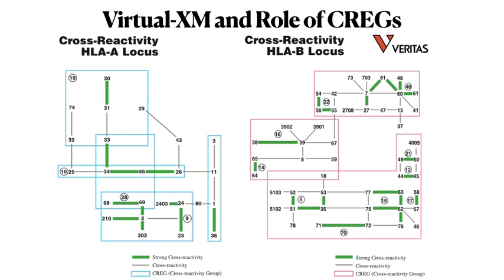So the patient is going to have cross reactive antibody reactivity. We may be thinking, no, it's only 60. No, it's not. It's going to have reactivity against 81 and 48. So we have to be a little careful about that.